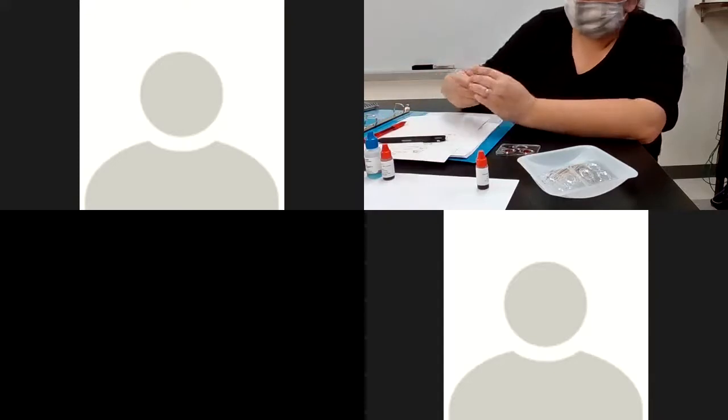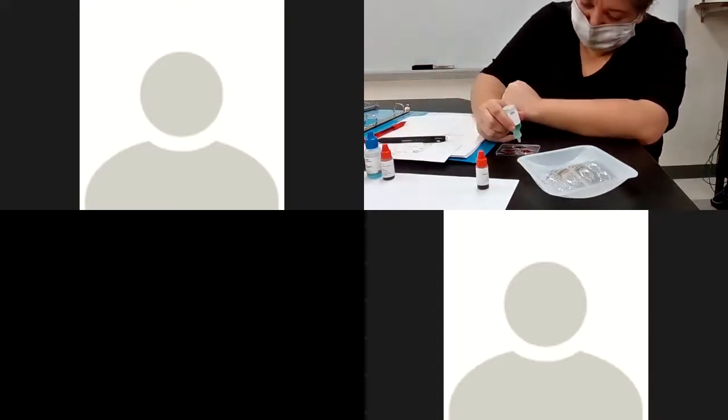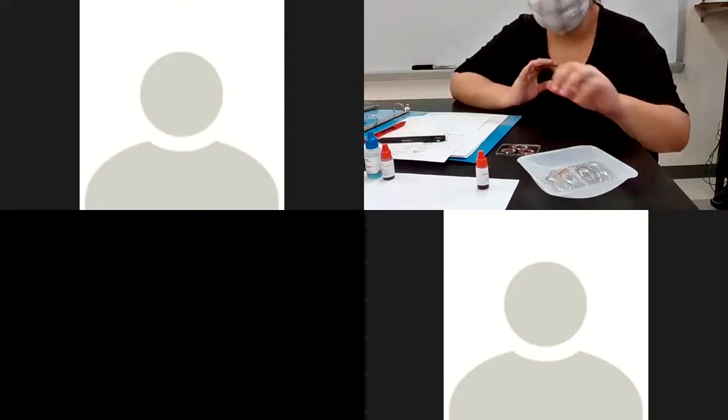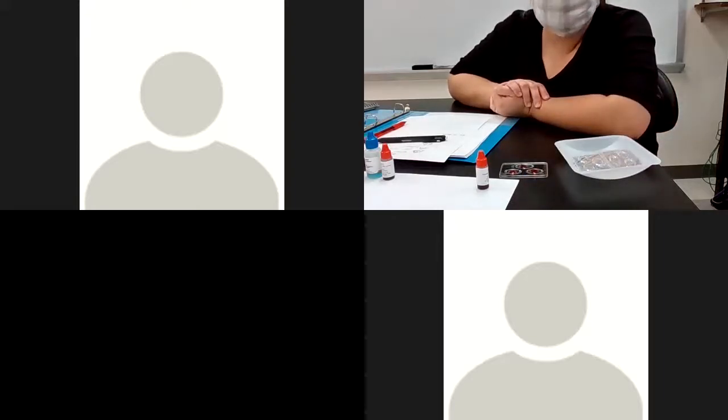Okay, now this is all chemistry and this is all fake blood. So, in a real blood test, remember that picture in your slide, how everything aggregated really quickly, the red cells to like a bead in the center, and everything that was left was kind of the plasma around it? If this is real blood, it looks like that. This is not real blood.